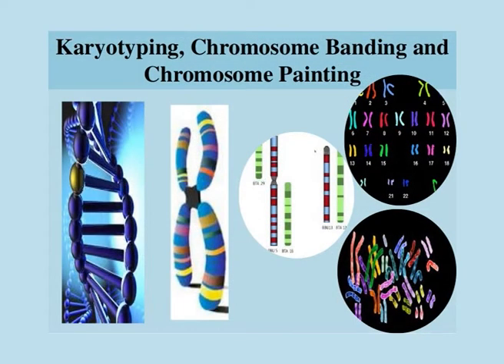The whole chromosome painting probes are complex DNA probes derived from a single type of chromosome that has been usually flow sorted or microdissected, amplified and labeled by degenerate oligonucleotide polymerase chain reaction to generate a paint which highlights the entire chromosome homogeneously along its side.